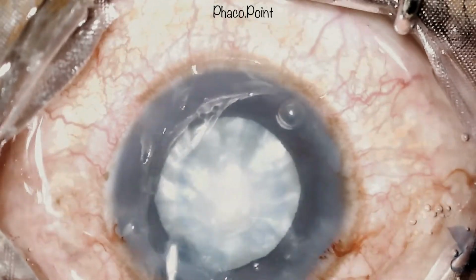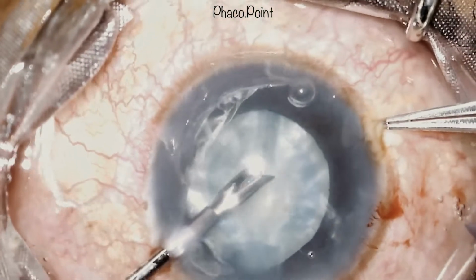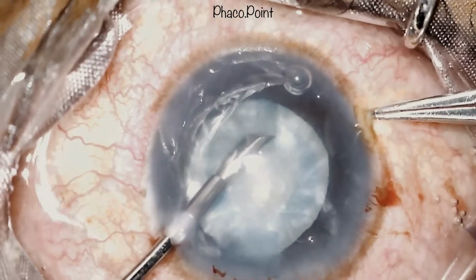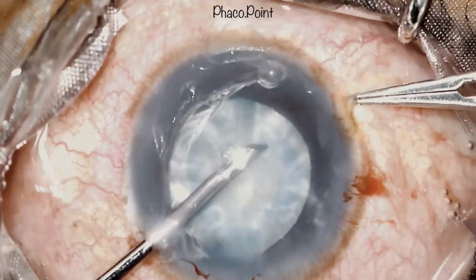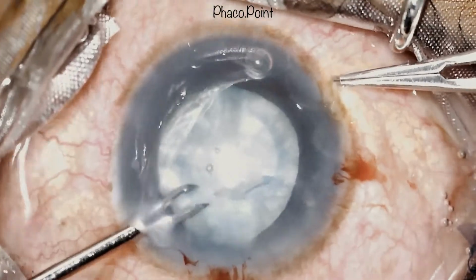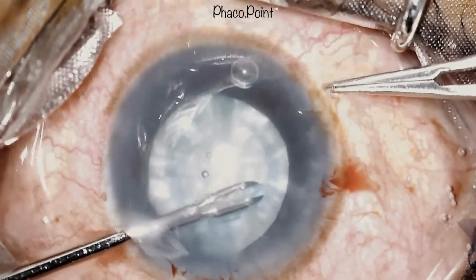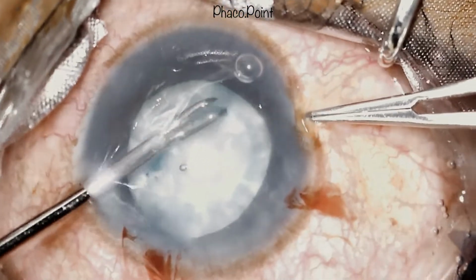After creating a nick in the smaller rhexis, in order to enlarge it, I need to introduce a pair of intraocular forceps. Now remember that what's different in this case is the fact that your working space is less, coupled with limited visibility. This may be a slightly challenging maneuver. Make sure that you do not endanger the corneal endothelium whilst doing this step.